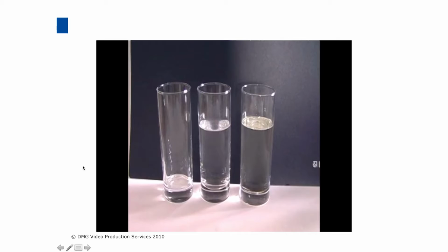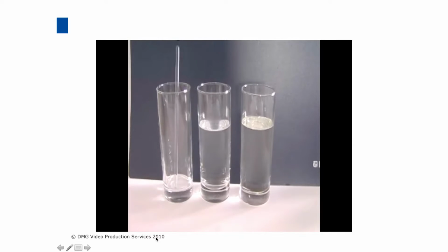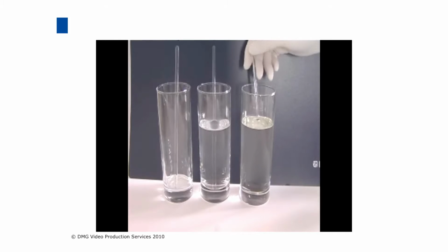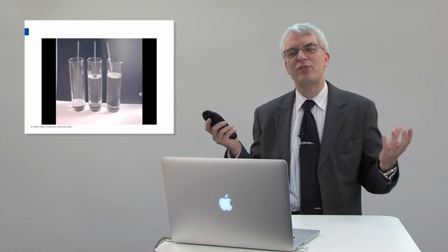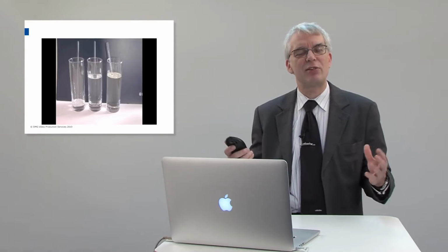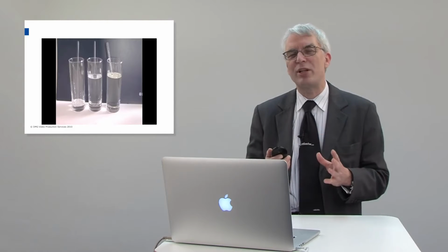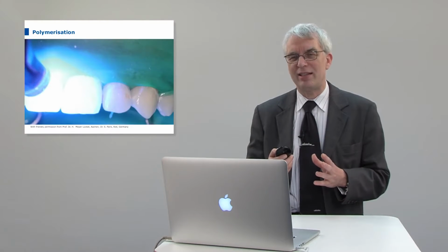And I want to show you a little video here again, where we can explain what happens. You can see the lesion because the refractive index is very different from enamel. If you place the alcohol, it starts to adjust, and the real magic happens when you apply Icon. Then all of a sudden your glass rod magically disappears because we've masked it. We have restored the translucency of enamel. That's basically what we're doing with the Icon treatment in this case.